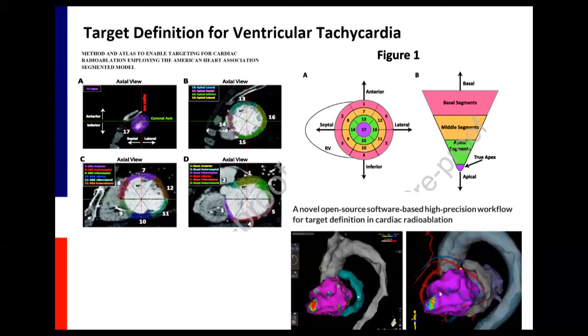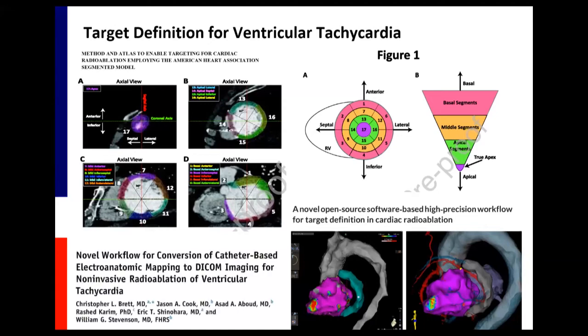But also, about deformable image registration, we're not even there yet. We really try to only import the data first to these systems. They're very incompatible. Cardiology and radiation oncology have not talked to each other ever. They're only starting to understand, okay, we think we need to do something here. But in the next 5 to 10 years, it will be really interesting to see this integrated in the treatment planning systems that we have.